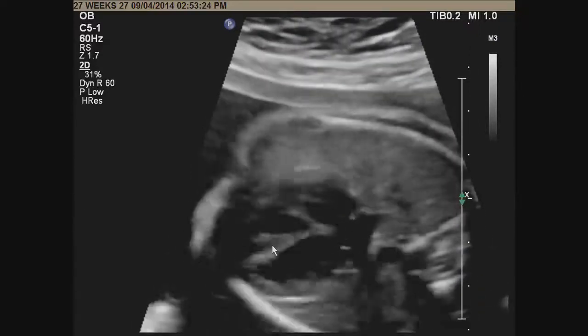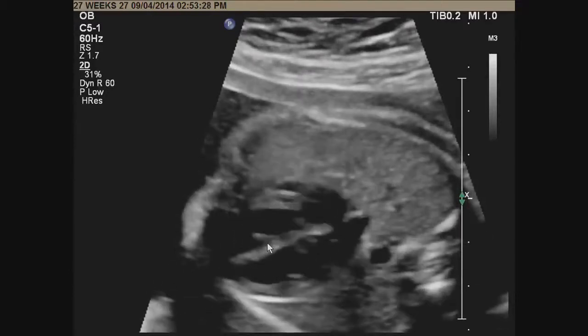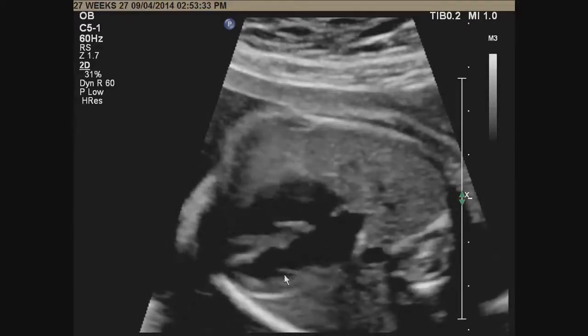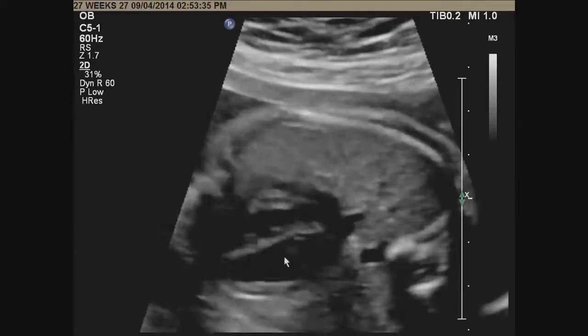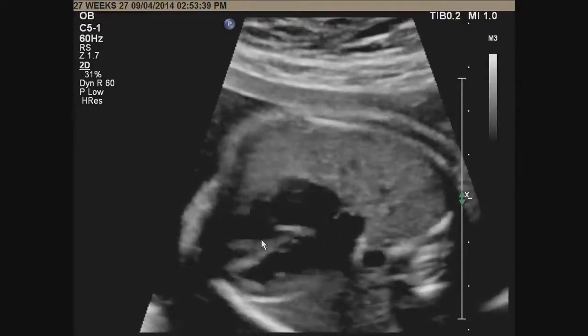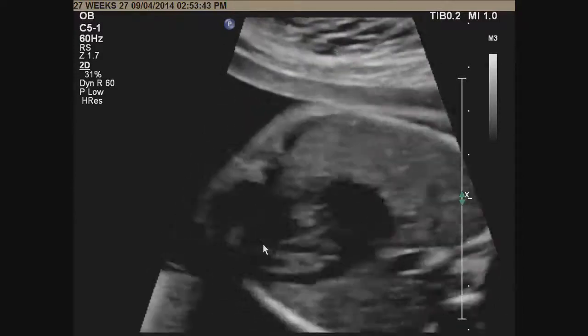There's septal insertion of the chordae tendineae in the right ventricle, a feature that is not available in the left. All the cords that come from the mitral valve insert into the two papillary muscles in the left side, whereas in the right side, as you know, there are three papillary muscles, but there are some free cords that insert into the wall. This becomes important if you're trying to determine situs of ventricle.